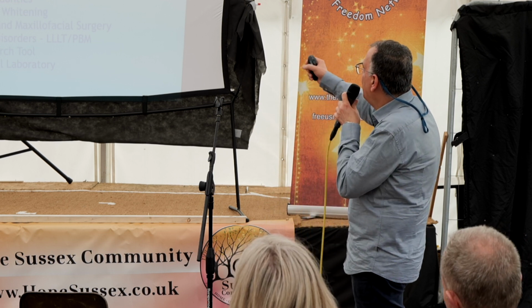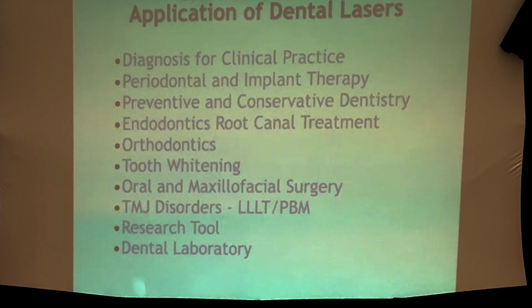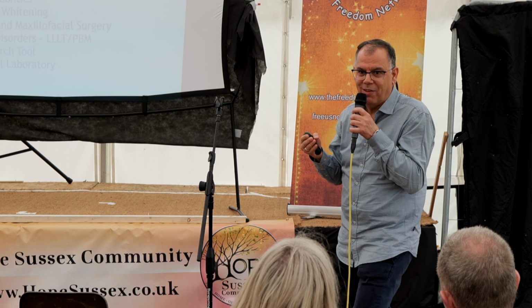Okay. So the application of dental laser is not only for perio or gum disease treatment. There are so many applications. It's in diagnosis and clinical practice. It's periodontal and implant therapy. It's preventive and conservative dentistry. As I said, with the hard tissue laser, instead of drilling, we could open the cavity with laser, only in a new caries area or decay in the tooth, because if it is filled with amalgam, we can't remove the amalgam with the laser, unfortunately.